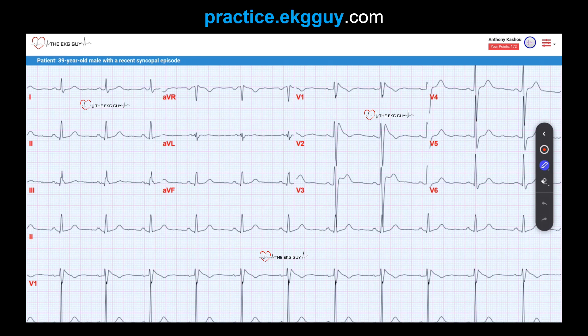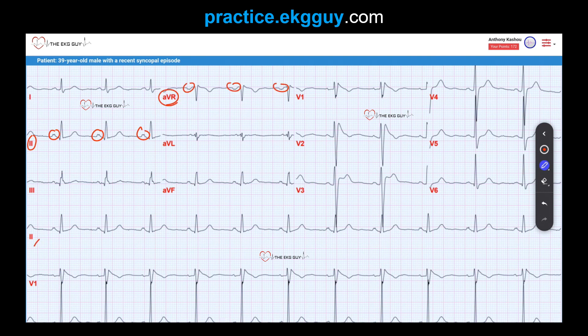Sinus rhythm is actually present here, and that's evidenced by the normal P wave axis, where we see upright P waves in lead II and inverted P waves in lead AVR. So here's lead II — notice these upright P waves — and then AVR. If you look at lead II down here and measure out all the P-to-P intervals, you'd see they were normal. The P wave morphology throughout this rhythm strip of lead II is also normal.